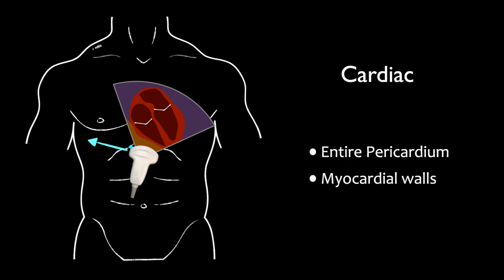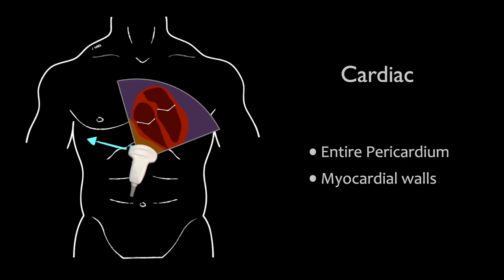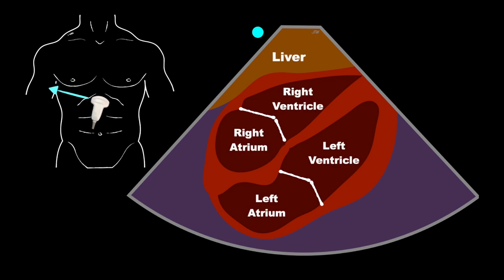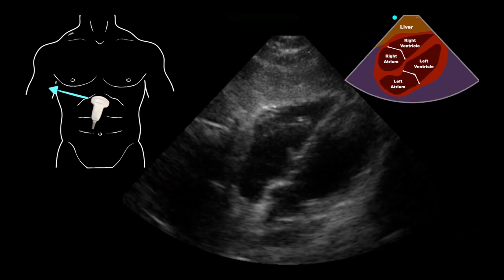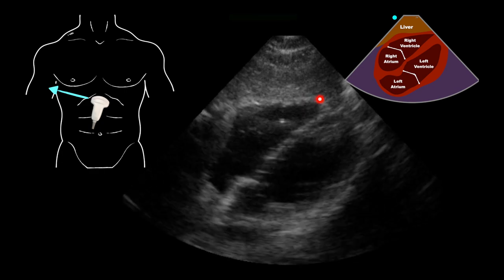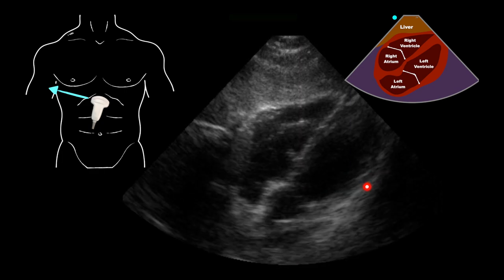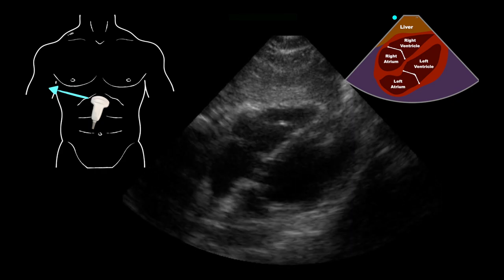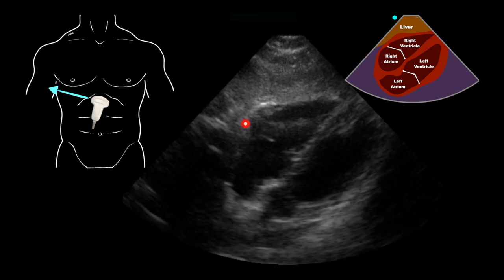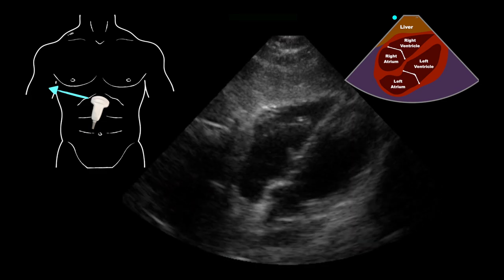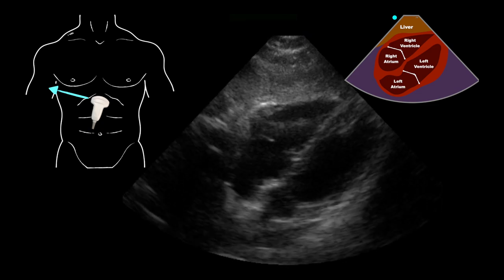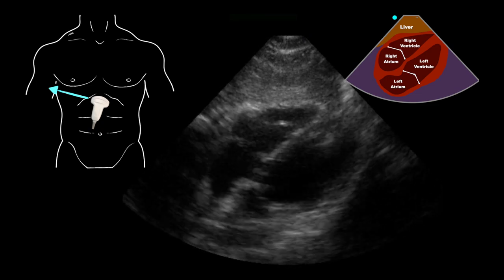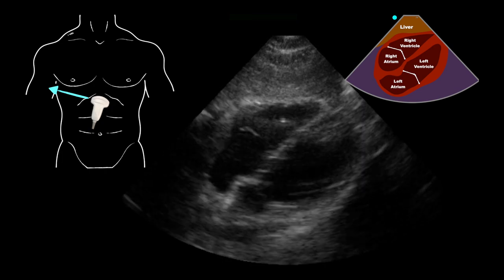With the probe marker pointed to the patient's right, we're going to look up towards the patient's left mid-clavicular line to left shoulder, and we'll get a view where we can see all four chambers of the heart — the right ventricle will be abutting right up against the liver wall. We're going to evaluate this area for free fluid along the right side of the heart, because an acute pericardial effusion or blood within the pericardial sac can compromise filling of the right ventricle, leading to hypotension.